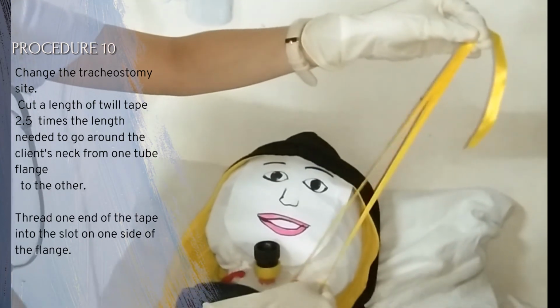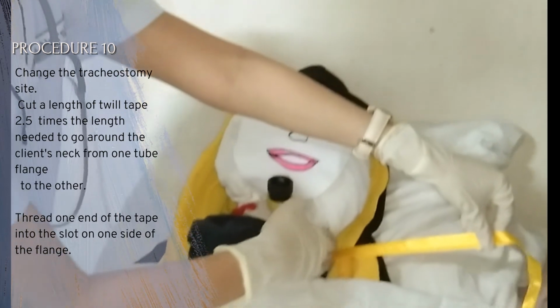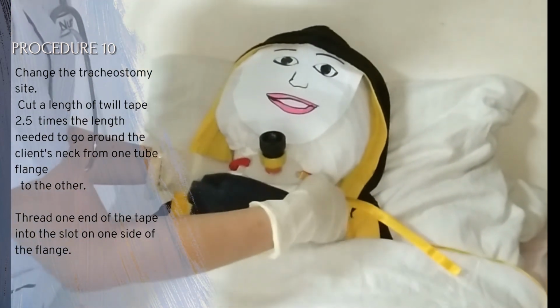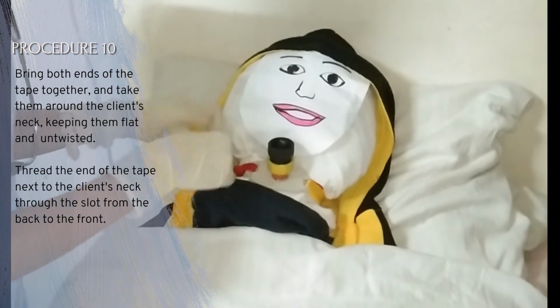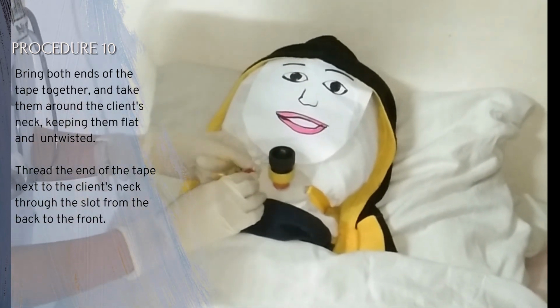Thread one end of the tape into the slot on one side of the flange. This is to secure the tracheostomy tube in place. Securing tapes in this manner avoids bulky knots, which can become irritating to the patient. Bring both ends of the tape together and take them around the client's neck, keeping them flat and untwisted. This is to keep the client comfortable and does not cause irritation to the skin.